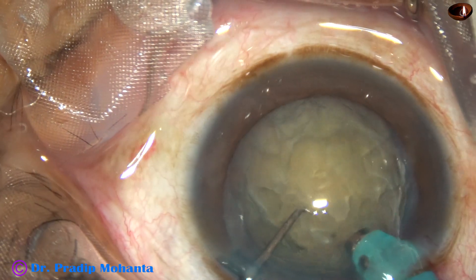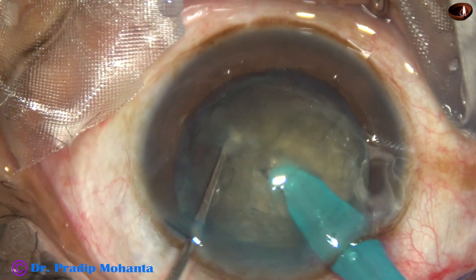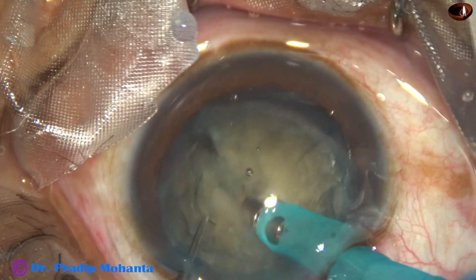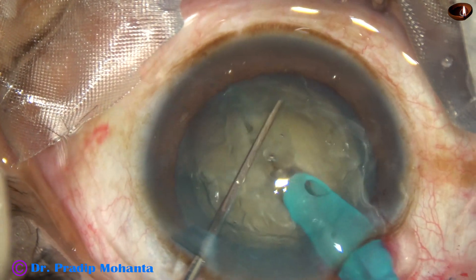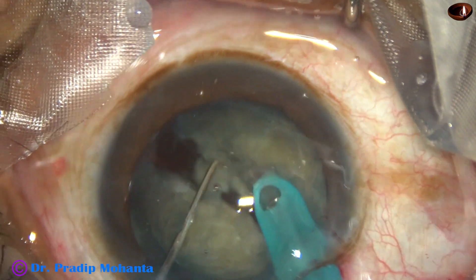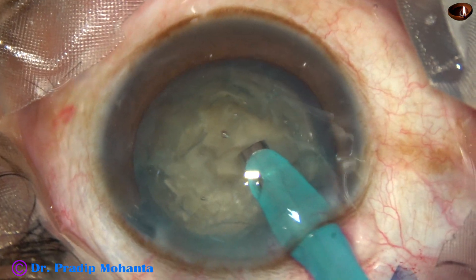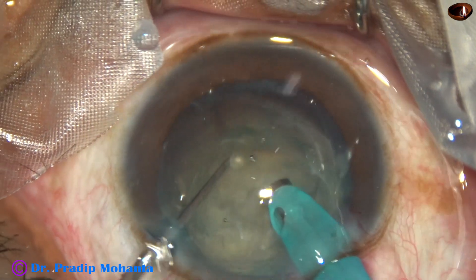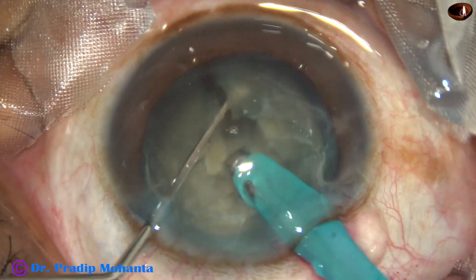I call it Submarine Chop. Bury the tip into the substance of the nucleus, go through the substance of the nucleus towards the opposite equator, and use the chopper after crossing the central part of the nucleus. The tip is always buried into the substance, and then high vacuum is used to hold the nucleus, and then the chopper is used.